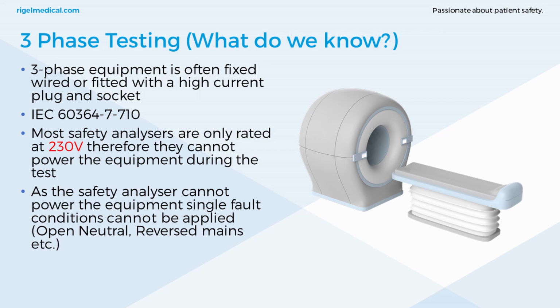Because of this, the safety analyzer cannot power the equipment and do the single fault conditions, so they cannot apply single fault conditions because the device is not plugged into the safety analyzer. So open neutral, reverse mains, etc. cannot be performed.